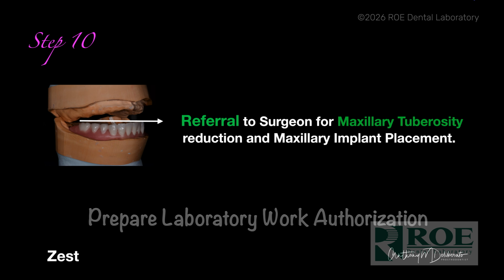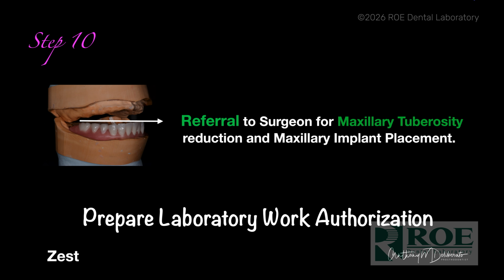And I send for a maxillary tuberosity reduction at the time that the surgeon is going to place the implants, because now the upper bone graft is healed. And so while he's in there placing the implants, I could ask him for a little more space for my denture base.